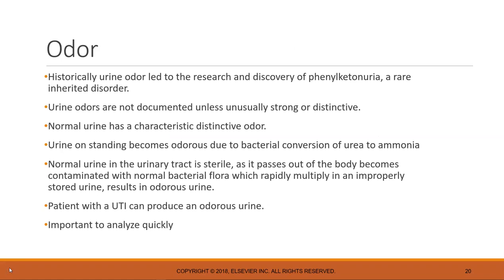Historically, urine odor has led to the research and discovery of phenylketonuria, a very rare inherited metabolic disorder. Urine odors are not documented unless they're unusually strong or very distinctive. Normal urine has a characteristic distinctive odor. Urine on standing becomes odorous due to bacterial conversion of urea to ammonia.